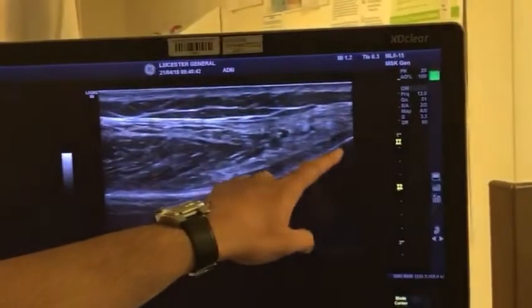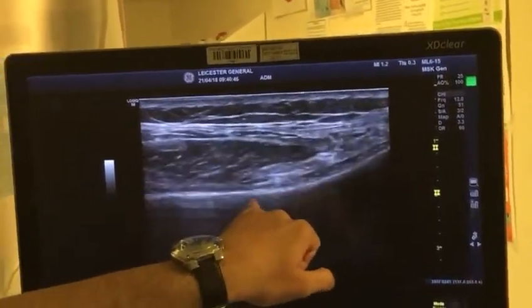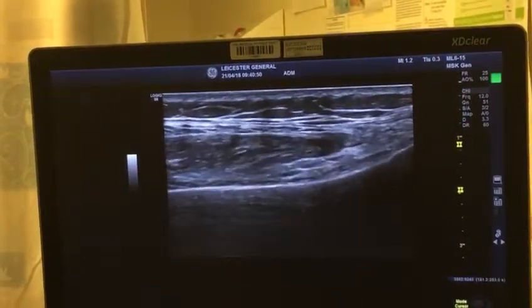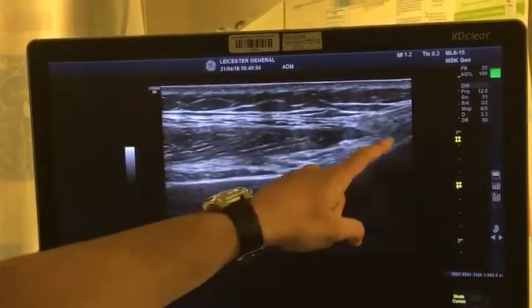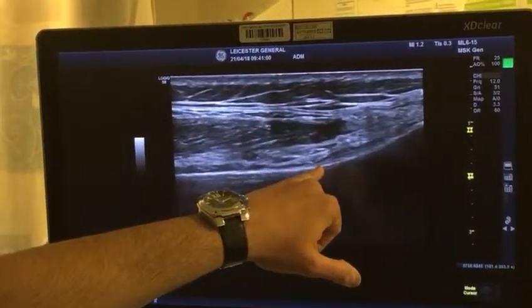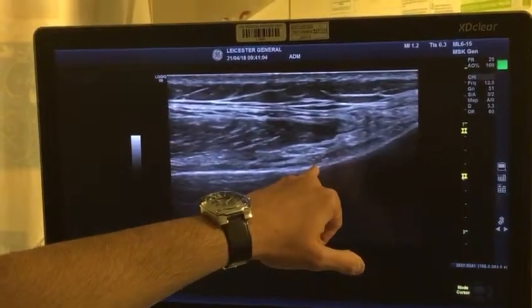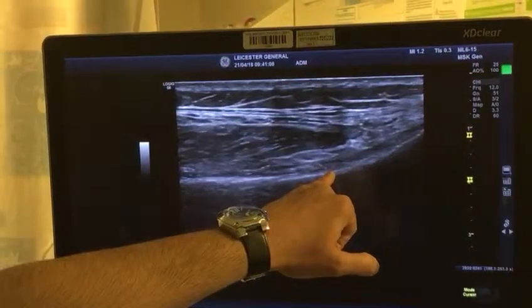There's a fantastic super medial artery there. This is your condyle and the shaft of the femur. You're looking for the arterial pulsation. If you don't see the pulsation, you want to go at the junction of the condyle and the shaft. When doing radiofrequency, I use that junction as a marker — bring the needle in and land there. That's your super lateral.